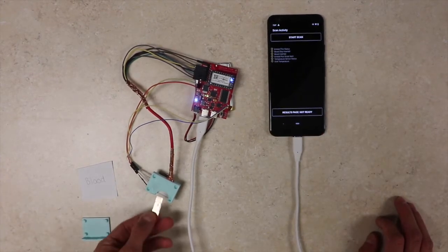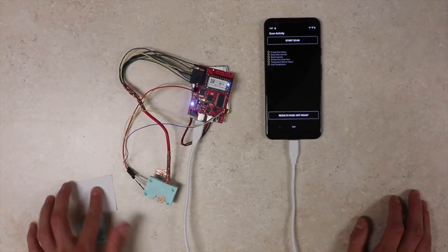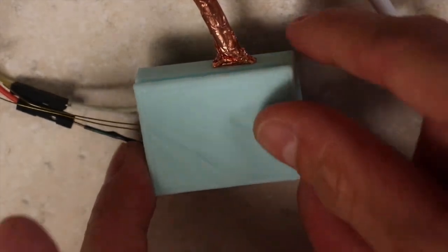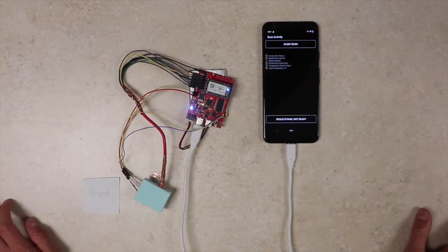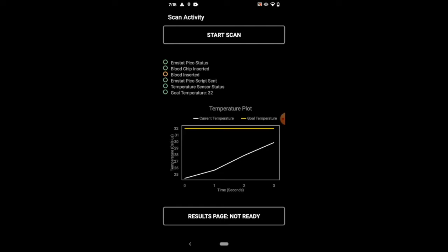Now what we do is we click Start Scan. From here, we insert the blood chip. Then what we do is we insert the blood, put that onto the chip, and then we cover it. Afterwards, we click Start Scan. Here, our status information turns green to show us where we're at. Then, the current temperature approaches the goal temperature.